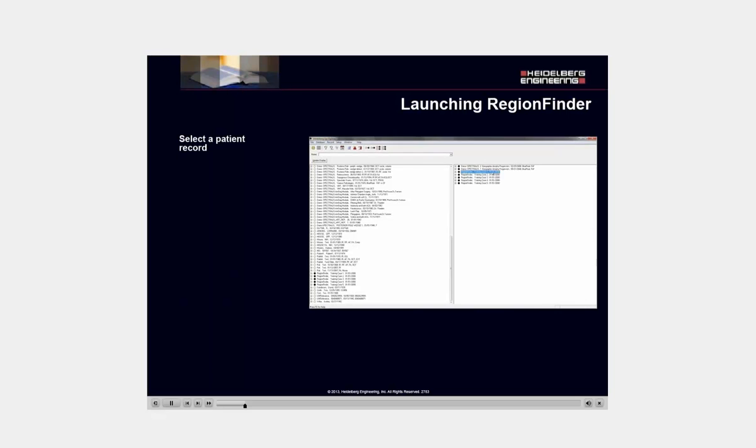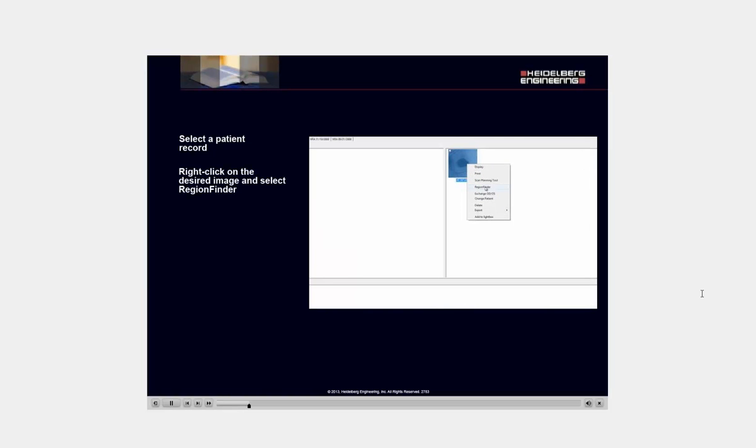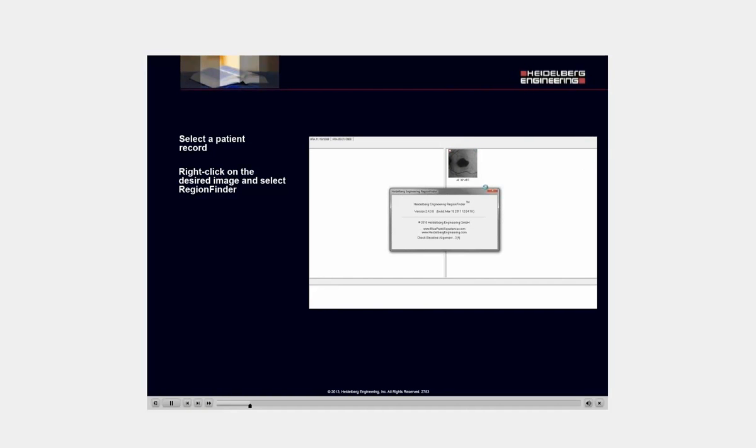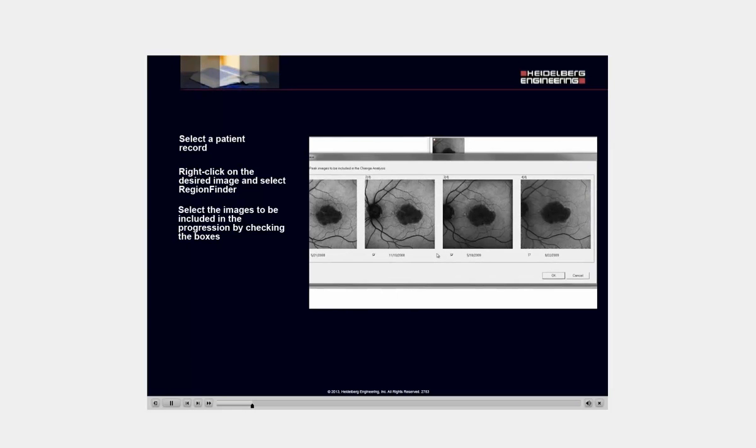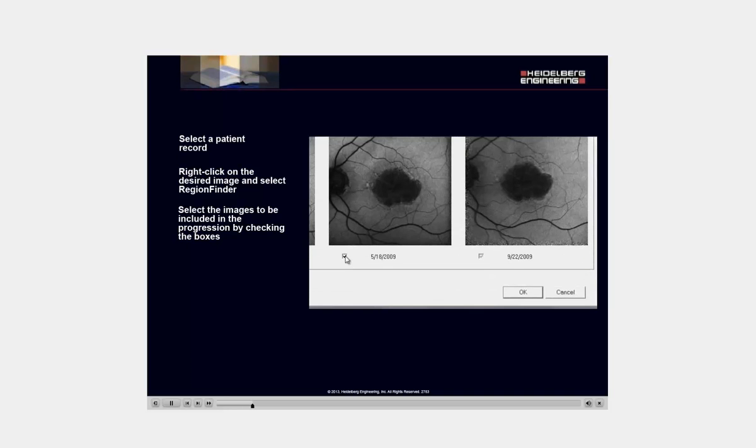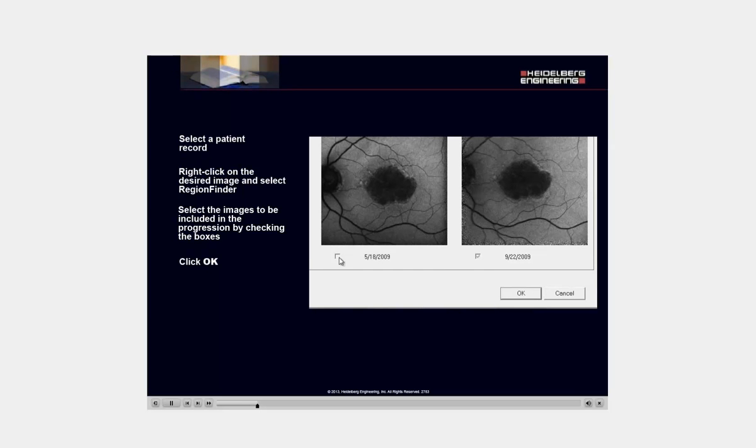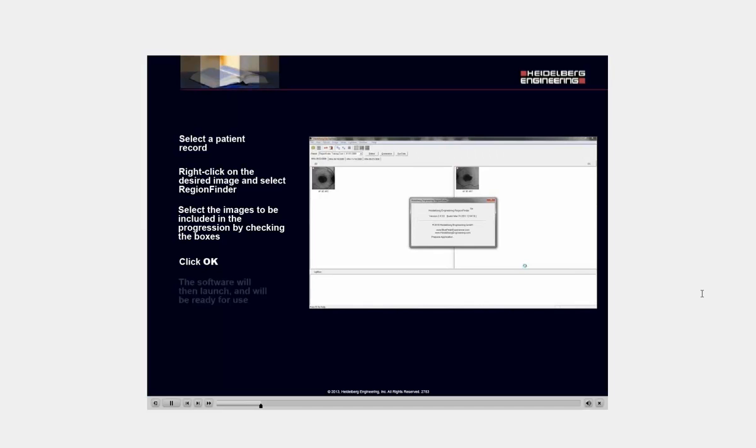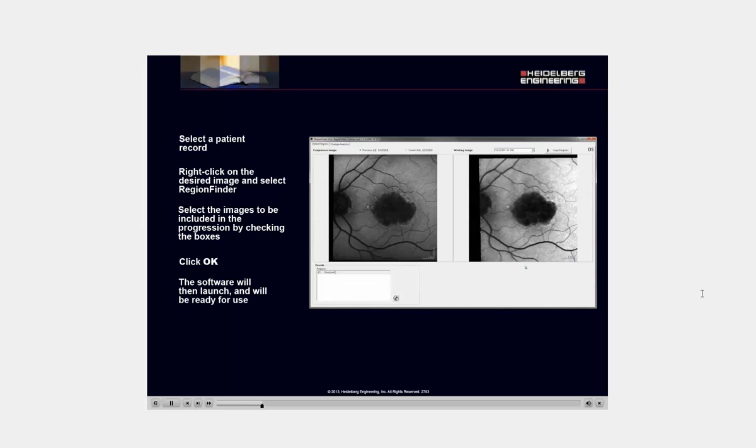Select a patient record. Right-click on the desired image and select Region Finder. Select the images to be included in the progression by checking the boxes. Click OK. The software will launch and will be ready for use.